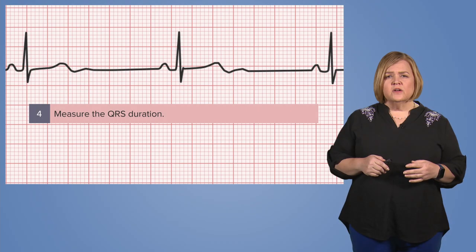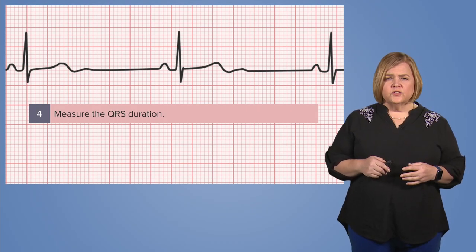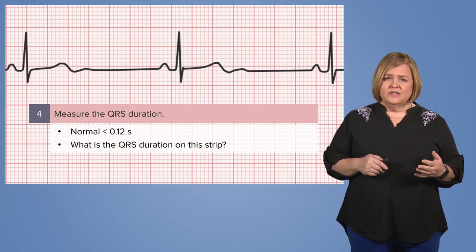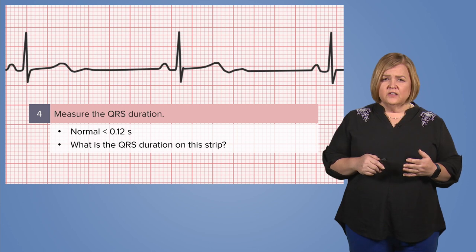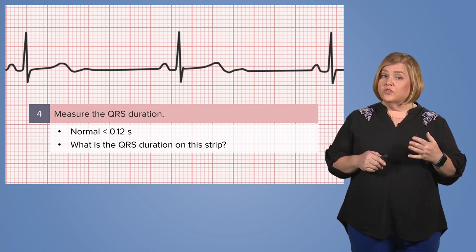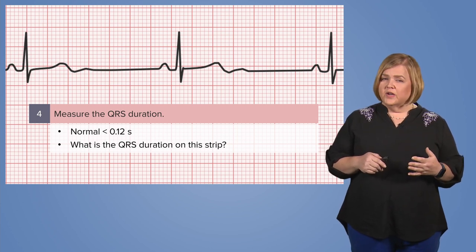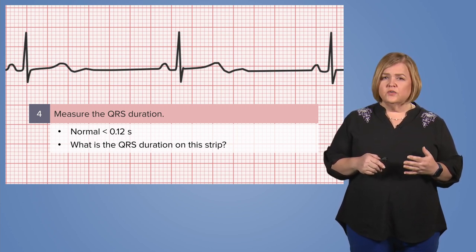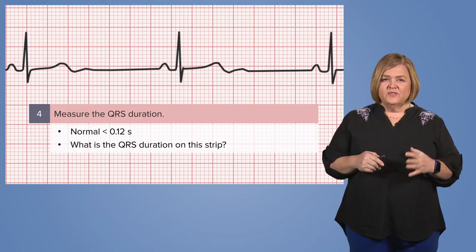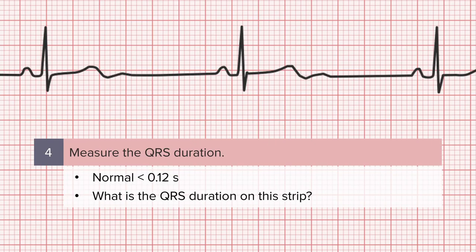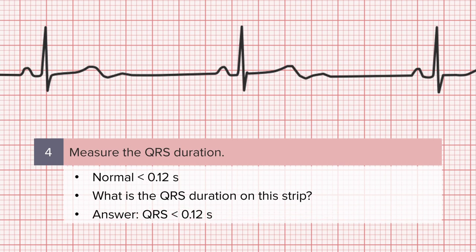Step four: measure the QRS duration. Less than 0.12 seconds, or 3 small squares, is considered normal. Pause the video, measure the QRS duration on this strip, and compare your answer with the one that will display.